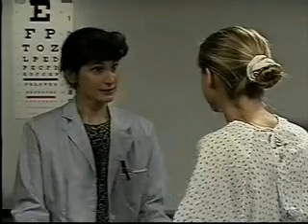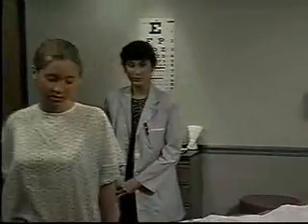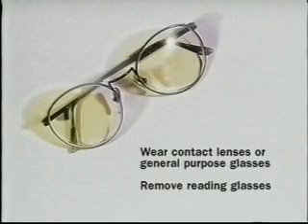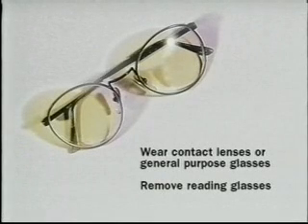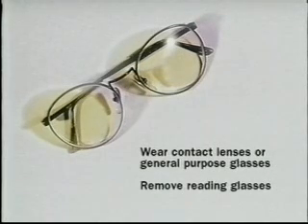Begin the eye examination by assessing the patient's visual acuity. To do this, have the patient stand 20 feet from a Snellen eye chart. If the patient wears contact lenses or general purpose glasses, tell her to wear them. But ask the patient to remove reading glasses because they blur distance vision.